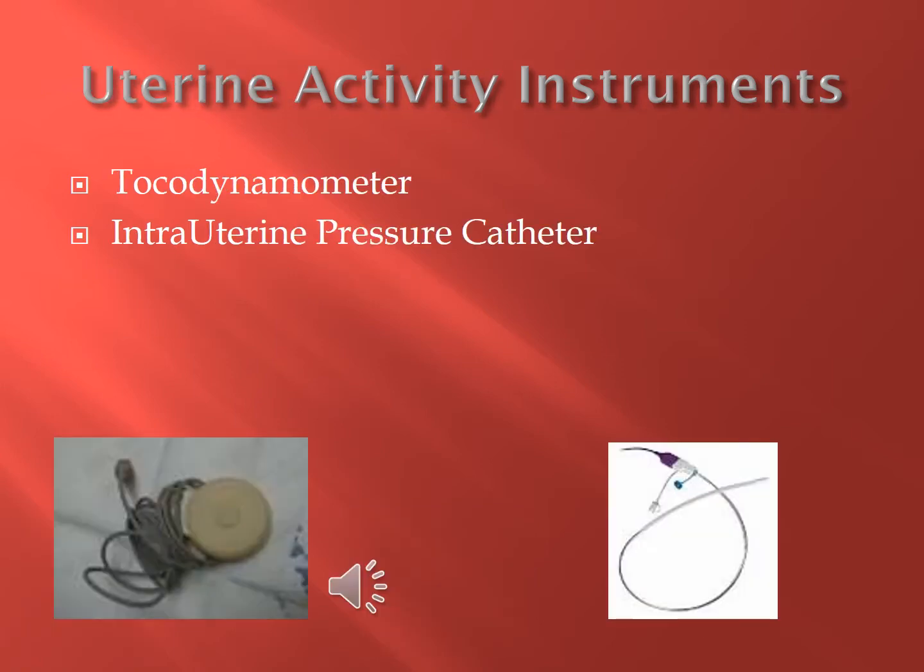The tocodynamometer monitors contractions by detecting abdominal wall contour changes. It monitors contractions, duration, and frequency. You need hands-on palpation to determine the intensity and tone. The pressure-sensitive side of the toco should be placed on the fundus. The limitations are that improper placement or maternal fetal movement can result in an unreadable tracing.